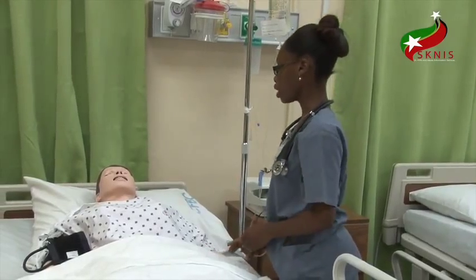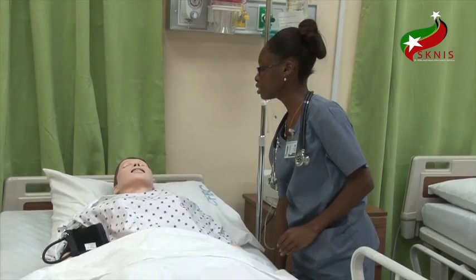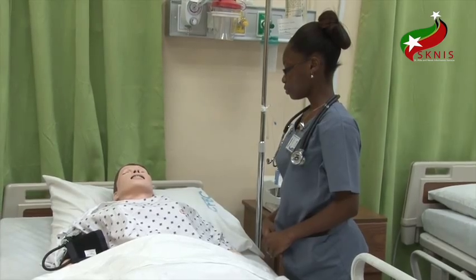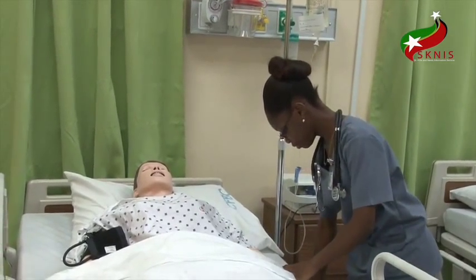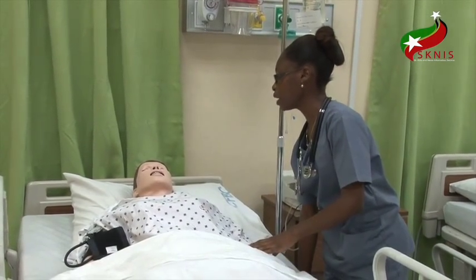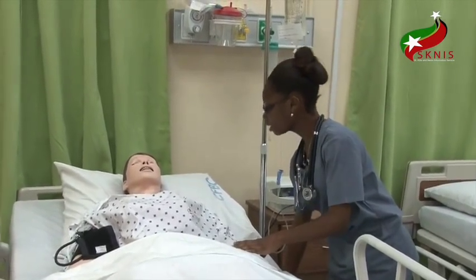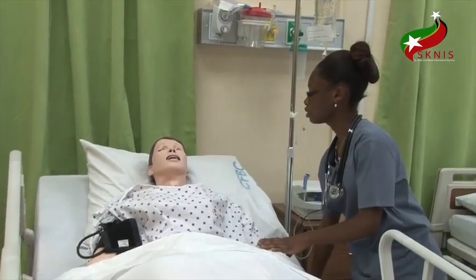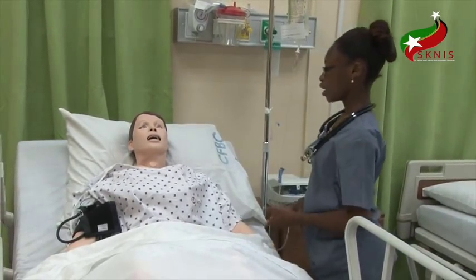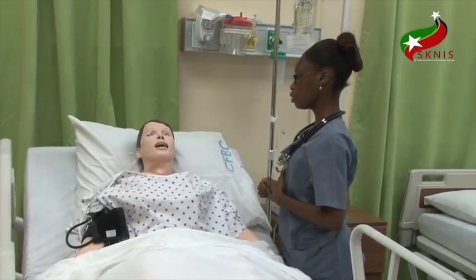Ms. Brown, could you please tell me how you are doing today? Ms. Anne? Hi, ma'am. I am feeling a little bit ill. It's hard to breathe. Okay then, Mrs. Brown, I'll just elevate the bed, okay? And tell me if you feel uncomfortable. Okay, Mrs. Brown, I'll do a quick evaluation of your lungs. Could you please allow me to expose the area, and I'll do some vital signs for you.